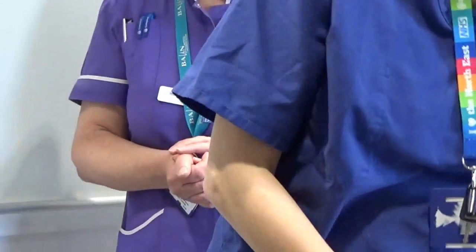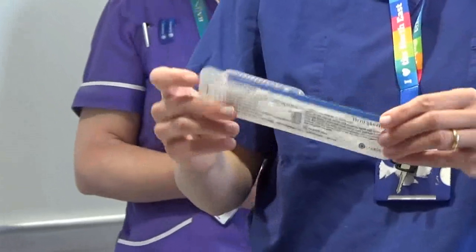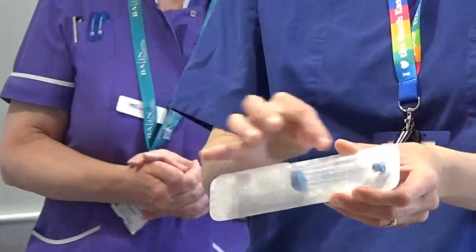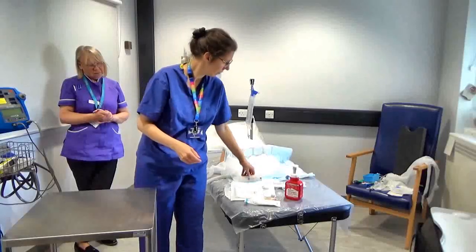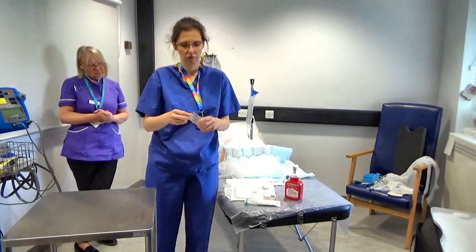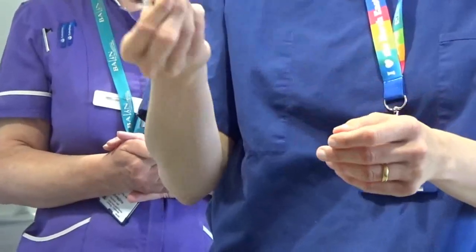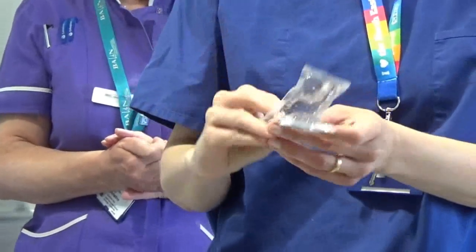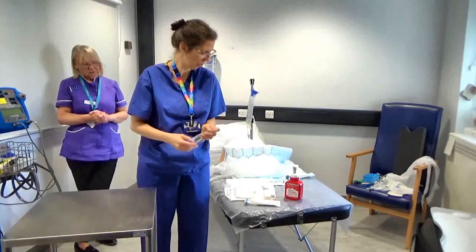What you also need for the catheterisation is instillagel. This comes in packs like this — a syringe filled with gel with a little bit of lignocaine in it. Furthermore, you need saline or water bags for cleaning — probably a good amount to start with.